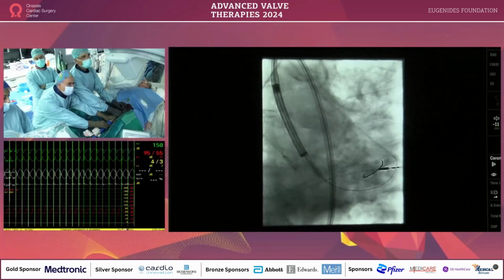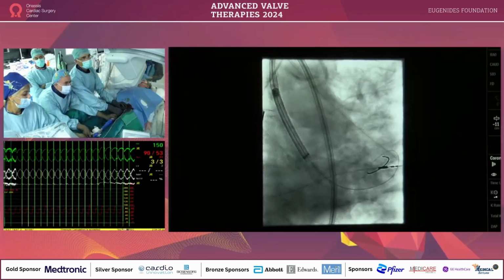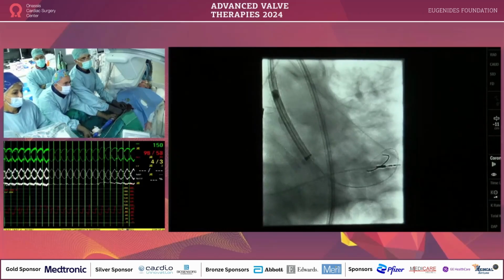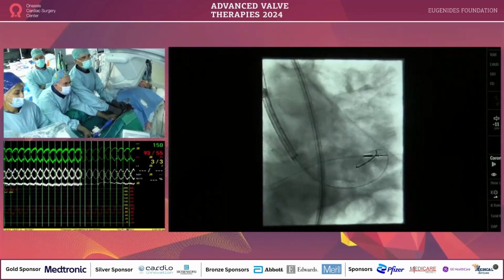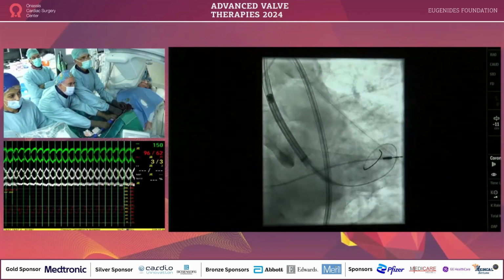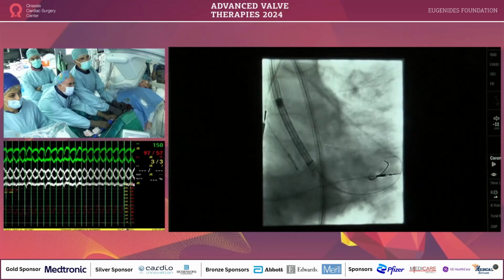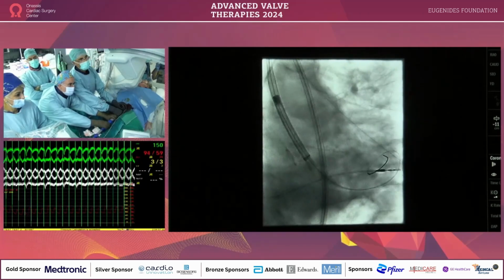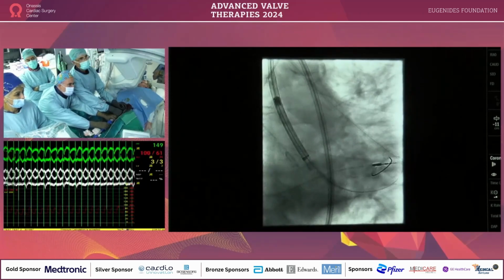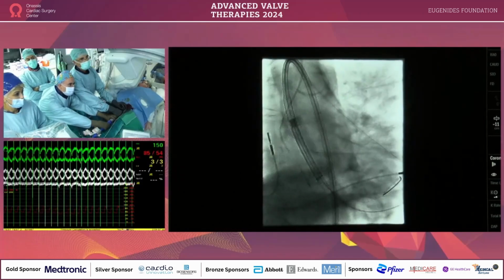That's very high. Advance it a little bit. That's very high. Very high. Very good now. Keep going. Injection. Okay. I think it's better like that. Okay, keep going, keep going.